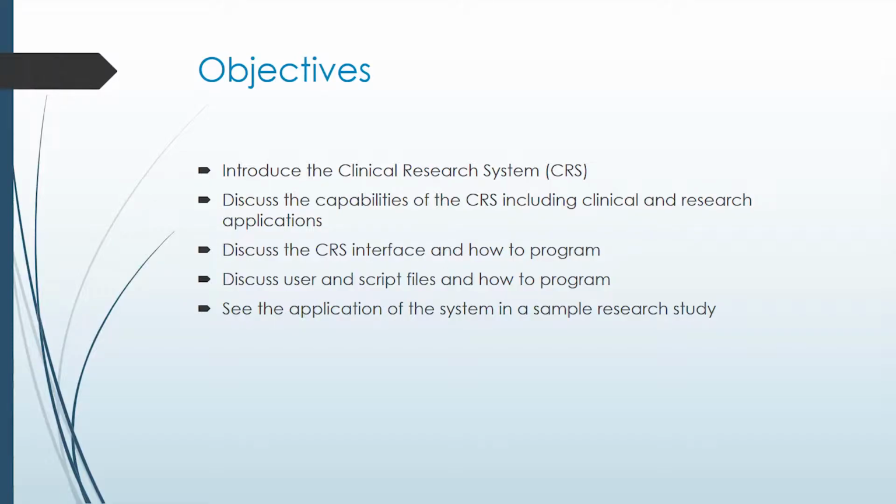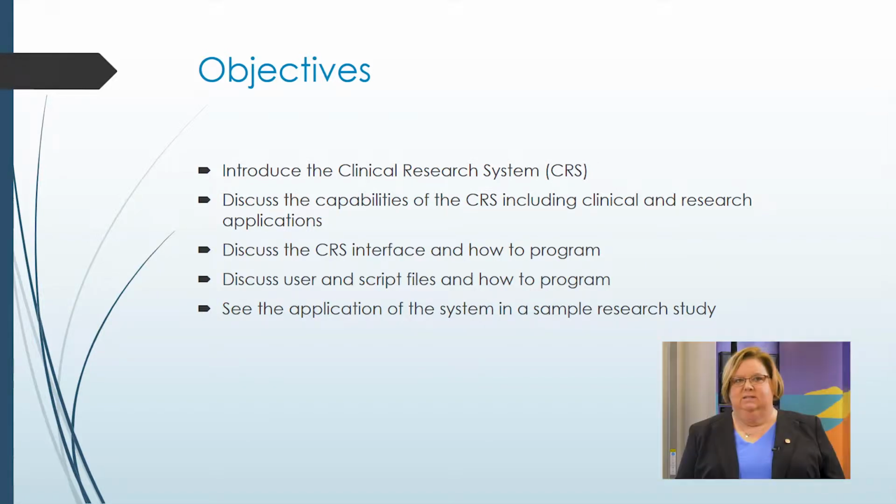Our objectives today are to introduce the clinical research system, to discuss the capabilities of the system in research applications, to discuss the interface, how to program it, discuss different ways to program, and then see the application in a sample research study.